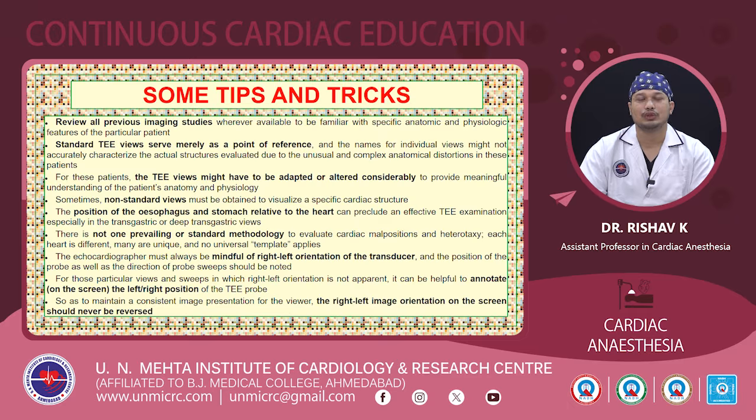Nonetheless, in most of the patients we can perform a detailed TEE examination, even in the context of abnormal anatomy. So there is not one prevailing or standard methodology to evaluate cardiac malpositions and heterotaxy. Each heart is different, many are unique, and no universal template applies. These are only the guidelines that we follow, but each patient will require a tailored approach depending on the findings of the echo examination.